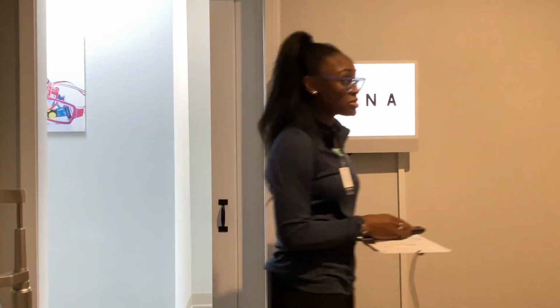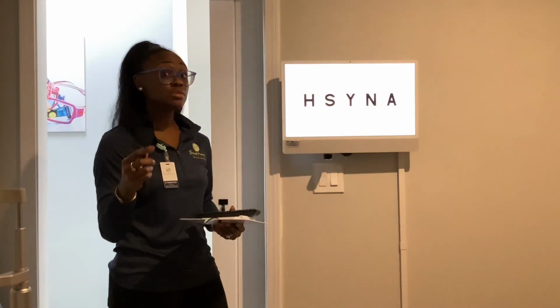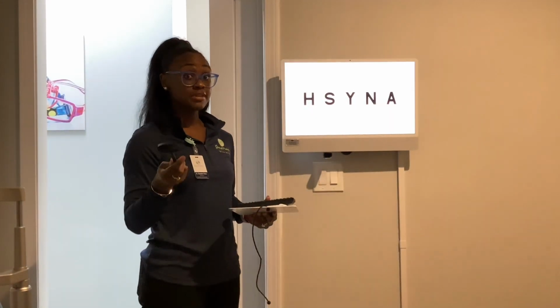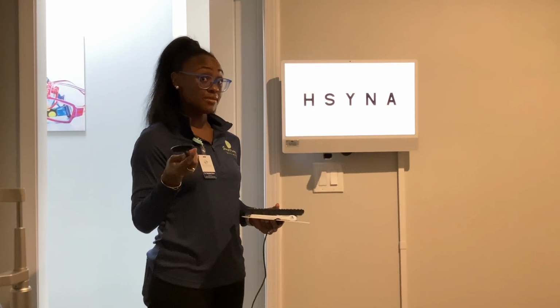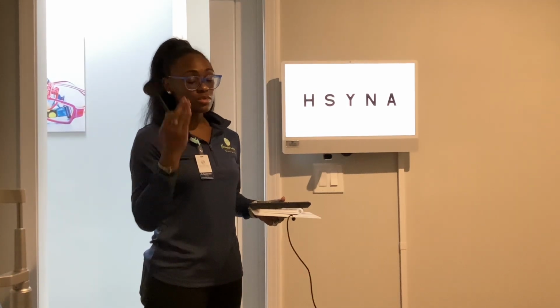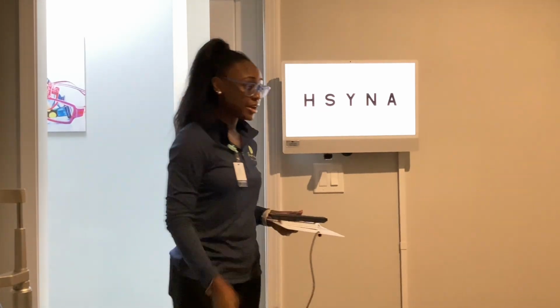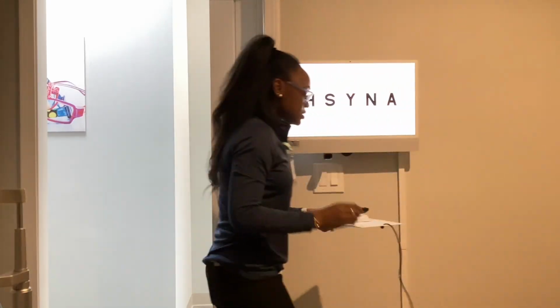So first what we're gonna do, we're gonna use an occluder. This is an occluder, all right? It occludes an eye. You're gonna cover the left eye first. We always like to test the right eye first, okay? In most situations, it doesn't really matter, but a general rule, start off with the right eye, meaning we're gonna occlude the left eye. This is my left eye, okay? Occluding the left eye. We can always start off with Snellen.